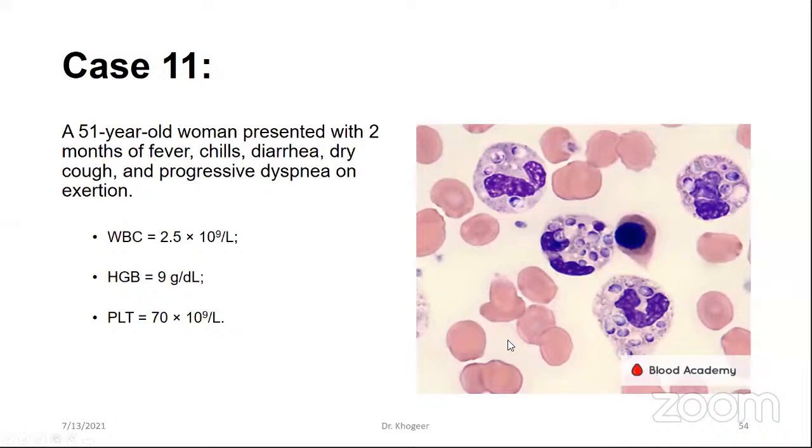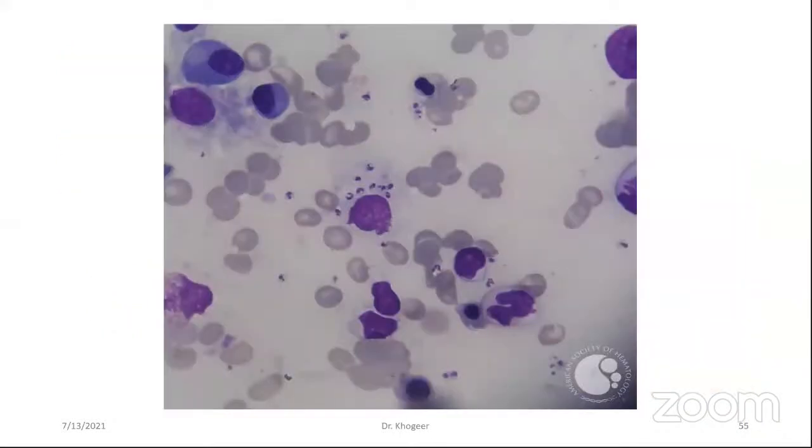Serum antibody and/or antigen research can make a diagnosis, but demonstration of the agent by culture or histopathological examination remains the gold standard method. So remember, Histoplasma usually shows intracellular inclusions, and this is a fungal infection. But this is another picture.